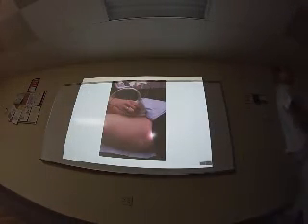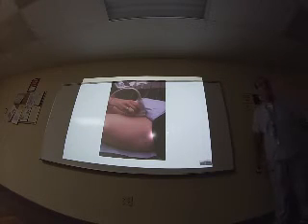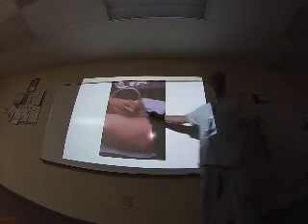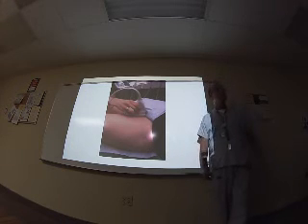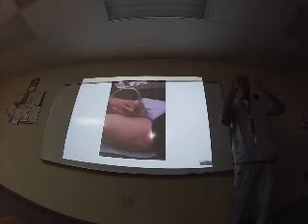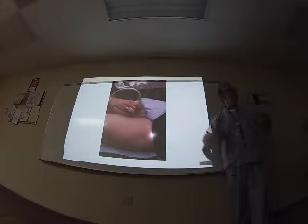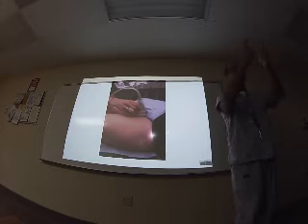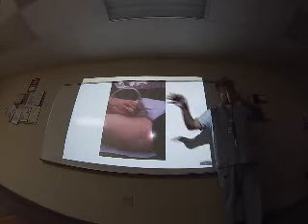This is a complex area to scan. You must be careful, especially if you are male. Be careful. There are a lot of complaints. Be careful when you are scanning areas like this. This is the problem of males in ultrasound. You must be 100% professional, and the most important, never look at the eyes of your patient. Talk, be nice, have good customer care, but never make fixation. Never look in the eyes, only at the beginning and at the end.